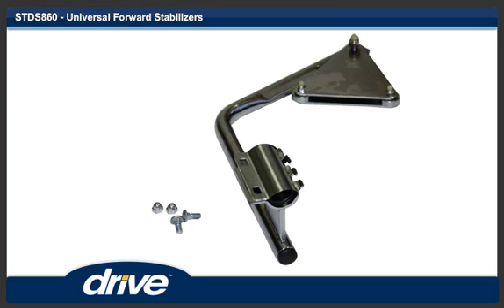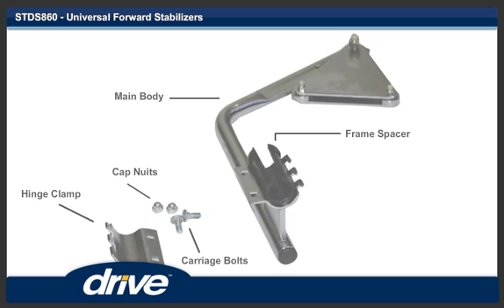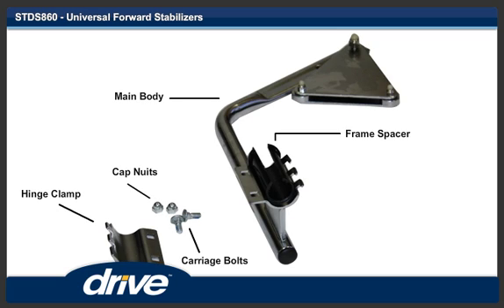Step 1. Remove the two carriage bolts from one front anti-tipper and separate all the parts.